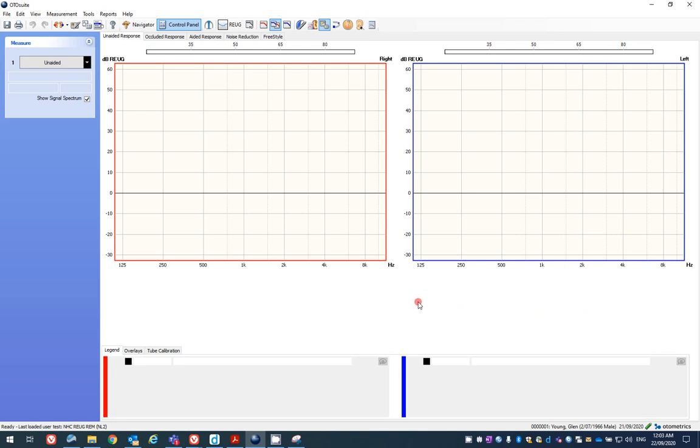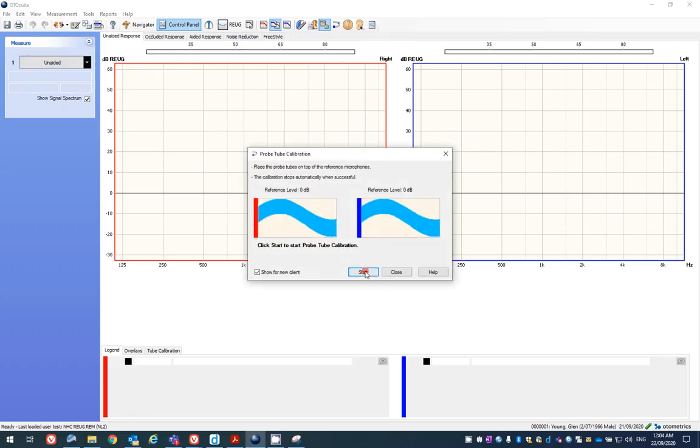Let's check on a really common issue we get calls for about the REM configuration. So I've connected to my Freefit. If I go to run my tube calibration, it failed: measured sound level is too low. I didn't hear any sound out of the speaker, just a very, very faint sound we might hear. So it's an indication that the speaker configuration is incorrect.